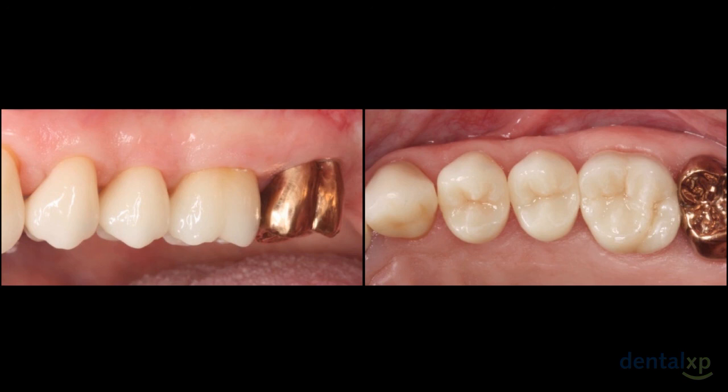So today we've talked about the treatment of a maxillary first bicuspid concavity. The important points are that we'd like to treat the line angles and not in fact the concavity. Now we at times will have to clean the calculus out of the concavity or plaque, but this is a very gentle procedure. The main shaping takes place on the line angles. In biologic shaping, we are going to remove 360 degrees of tooth surface wherever a CEJ is present.